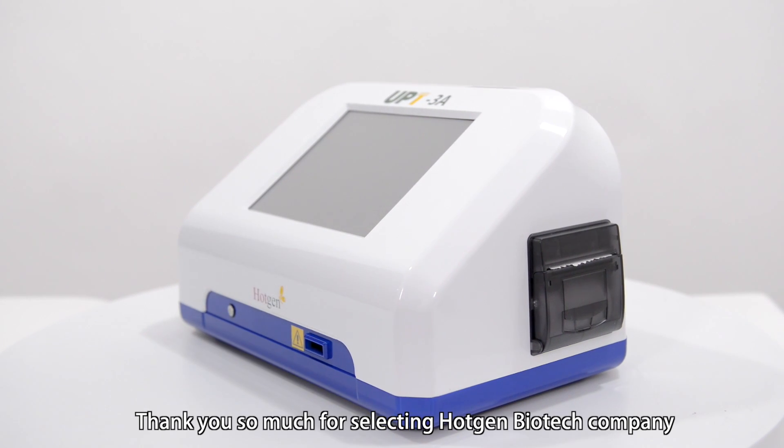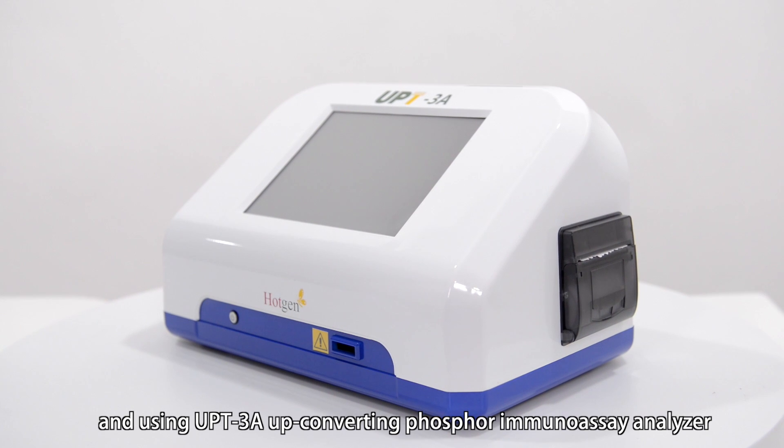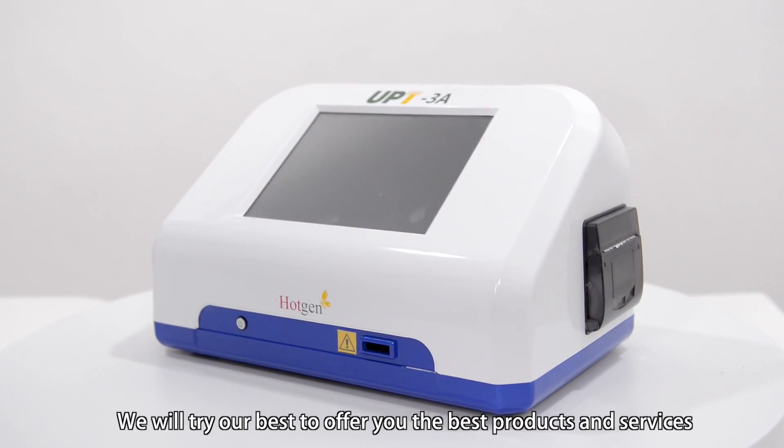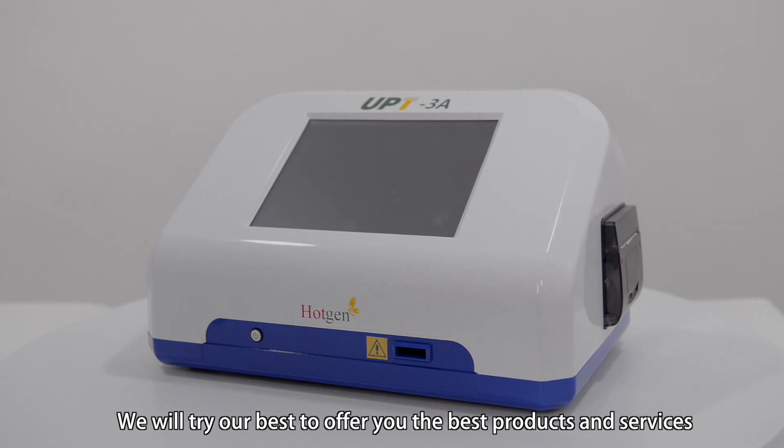Thank you so much for selecting Hotgen Biotech Company and using the UPT3A Up Converting Phosphor Immunoassay Analyzer. We will try our best to offer you the best products and services. If you have any problems, please call our after-sales service line at +86-10-5652-8836, or email us at service@hotgen.com.cn. Thank you.